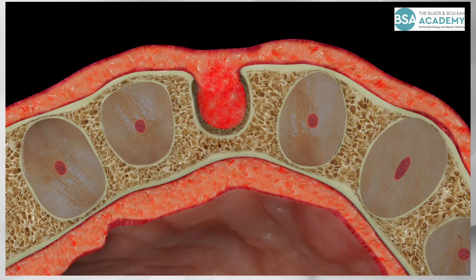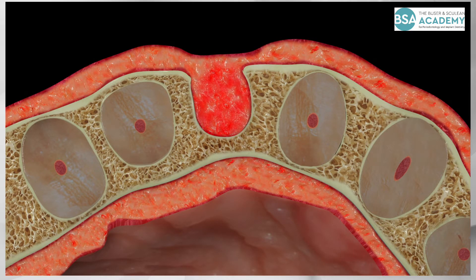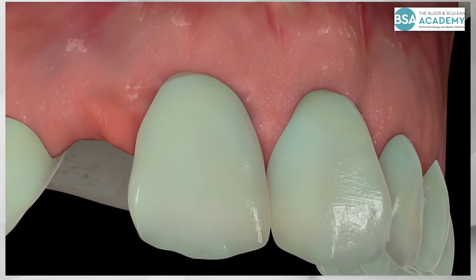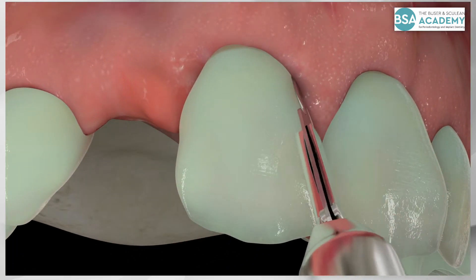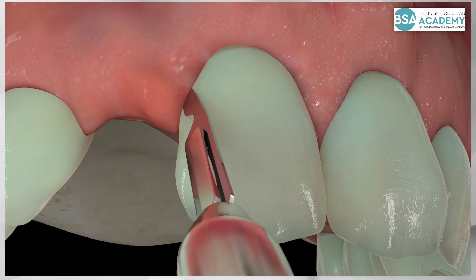Simultaneously, a flattening of the soft tissue contour takes place in the middle of the socket. 8 weeks post-extraction, implant surgery is initiated.